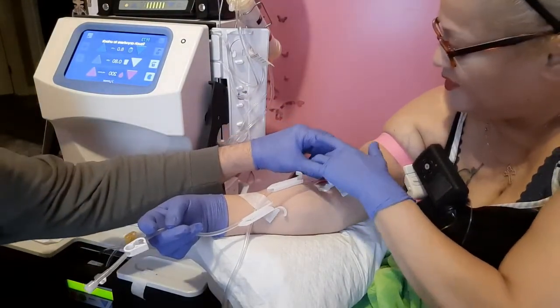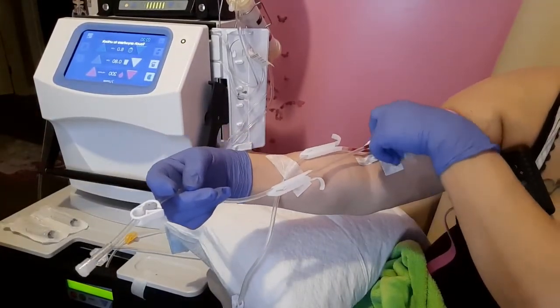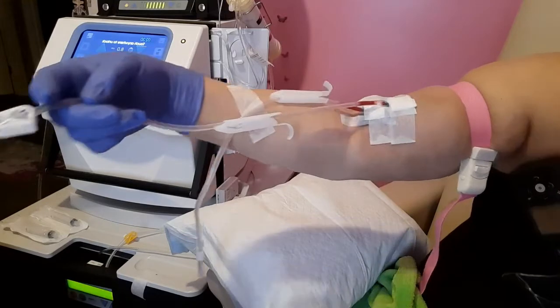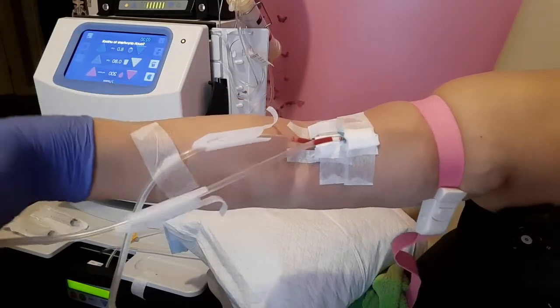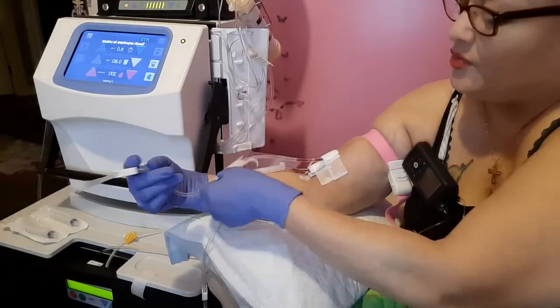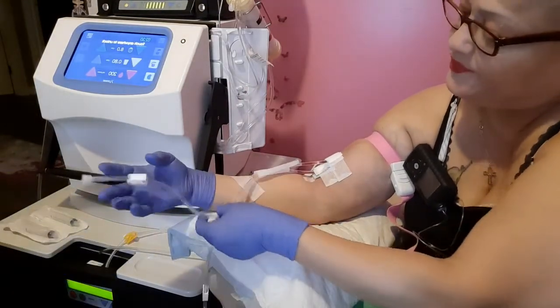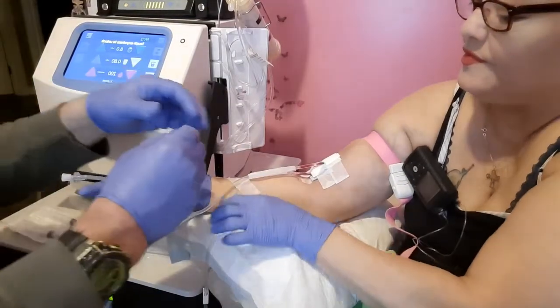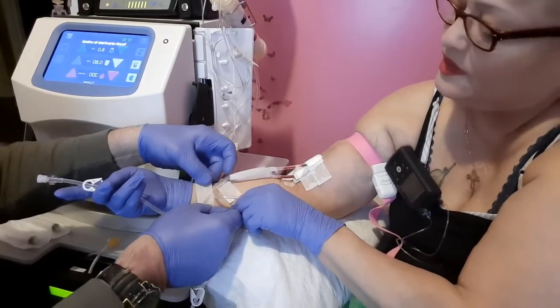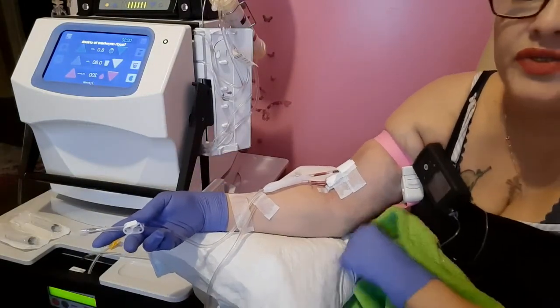Okay, so he's got both tapes down. So now I've got to cover the needle entry point. Okay, as you can see, I have a flash on both lines. Okay, that's a good sign. So we're going to tape this also to my arm. Very good.